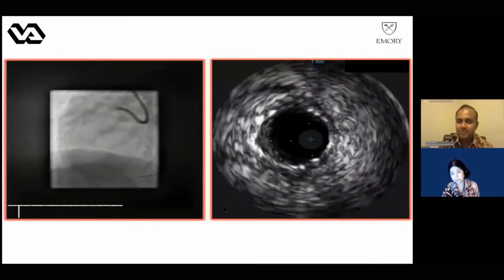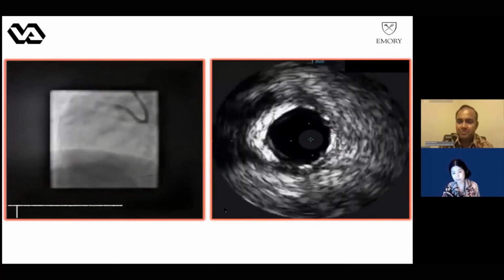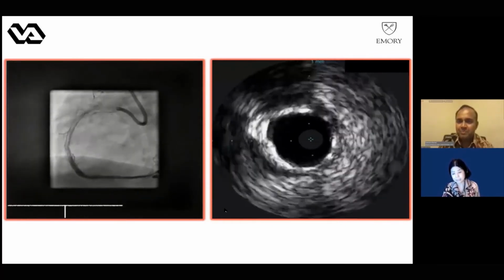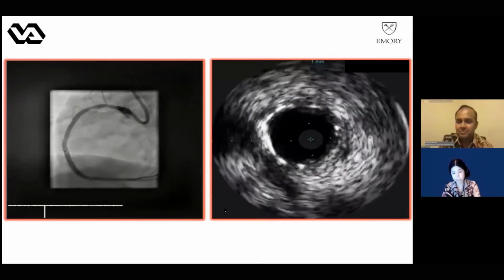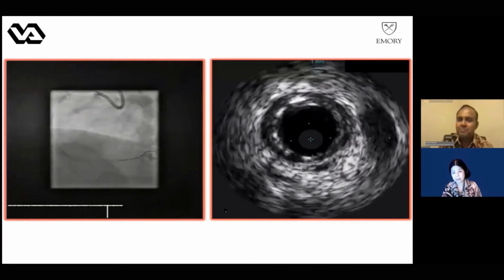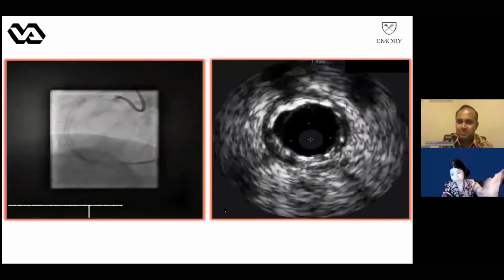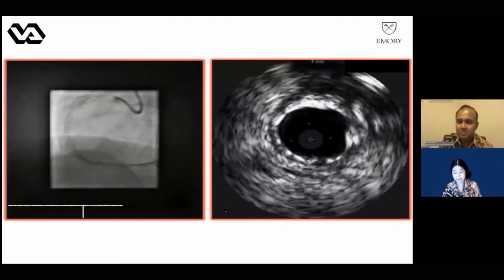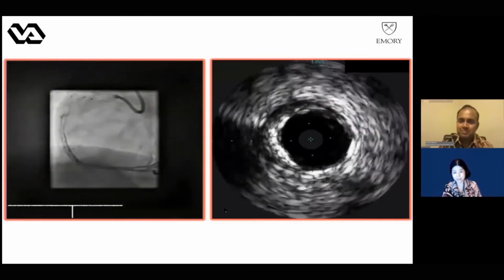But if you want more detail on the mechanism, you have to make the fracture behind the stent. But it's really fracturing everything. You see the calcium behind the stent. But in this case, because it's very well fractured, I really don't see any calcium fracture to point to in this picture, but anyway, it's very good expansion.